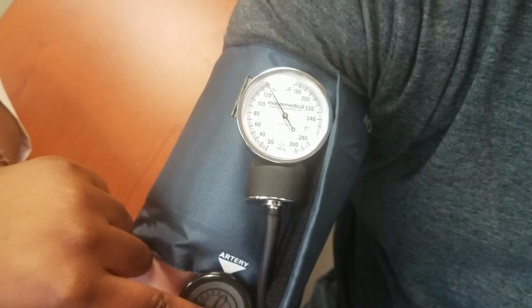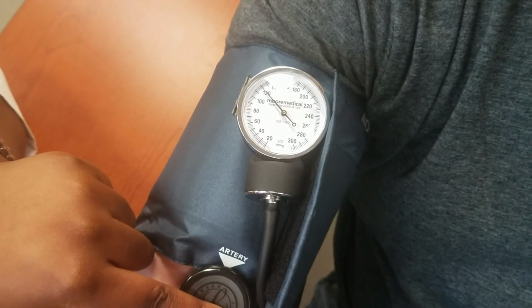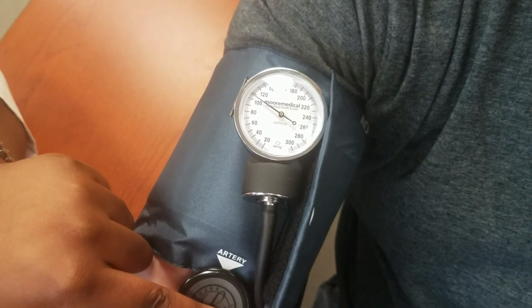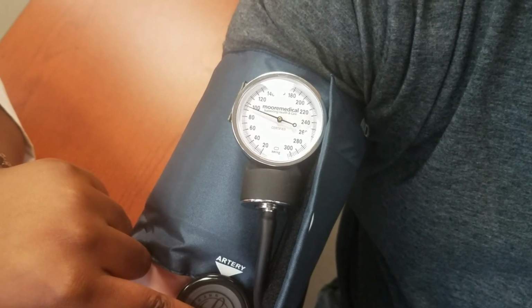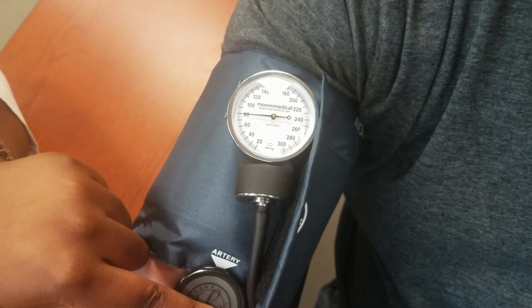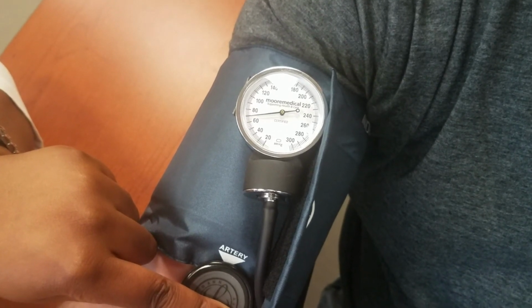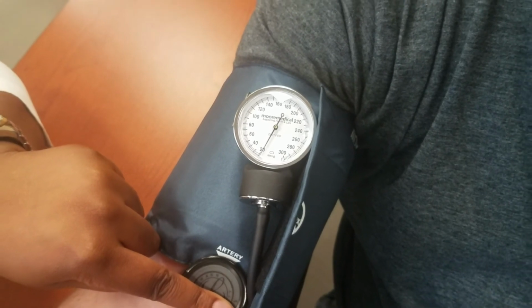When you hear the first knocking sound, that will be the patient's systolic blood pressure. Make sure to make note of that and continue to deflate the cuff at a rate of 2 to 3 millimeters of mercury per second. When you no longer can hear any knocking noises, that will be your diastolic blood pressure, but continue to deflate the cuff 5 more millimeters of mercury before you rapidly deflate the cuff and remove it from the patient.